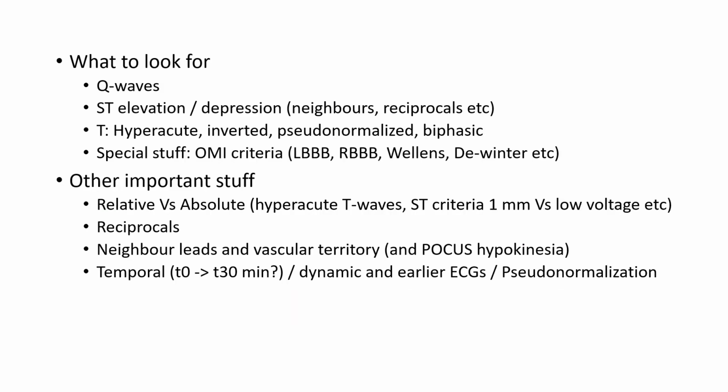So what do we look for when we have a patient we may think has ischemic chest pain or ischemic symptoms that may be atypical, like rarer dizziness, but more often dyspnea, especially in older women with diabetes or neuro deficits? We look for Q waves, right? We look for significant Q waves, as we mentioned before, what the definition is for that.